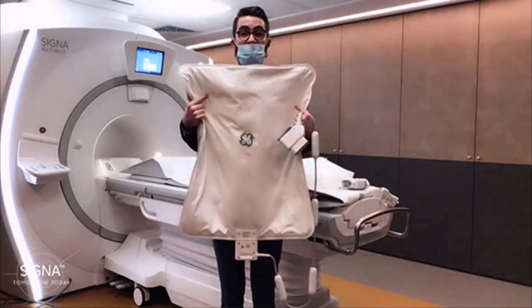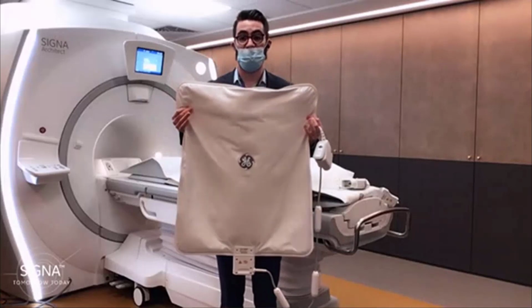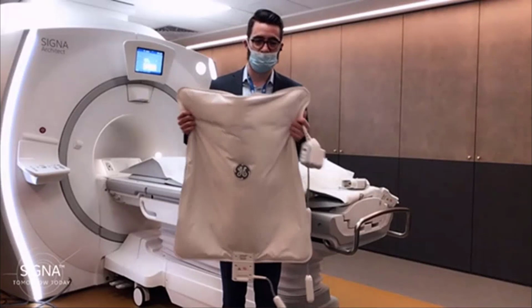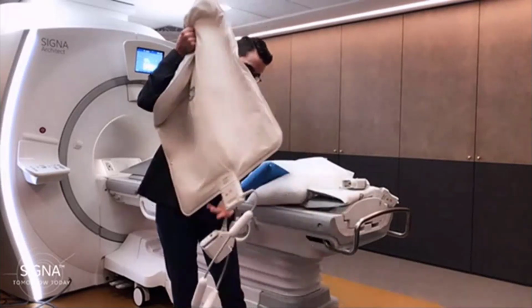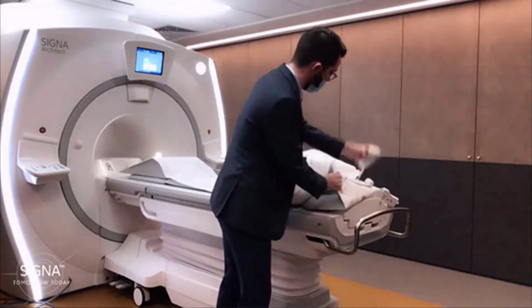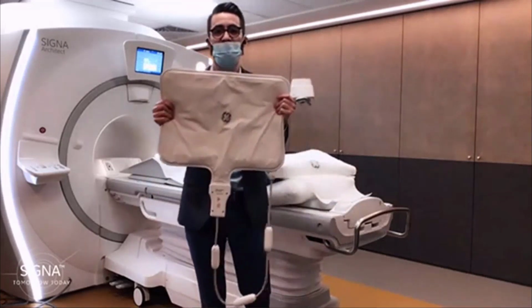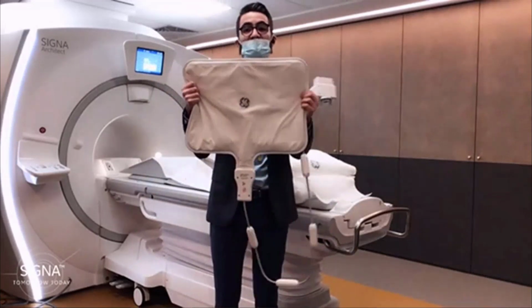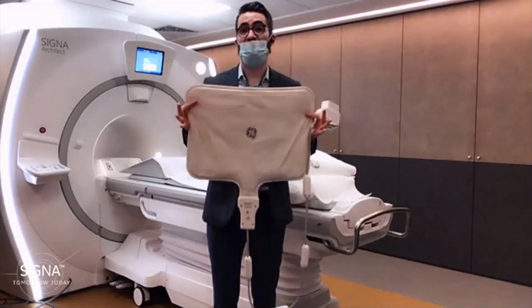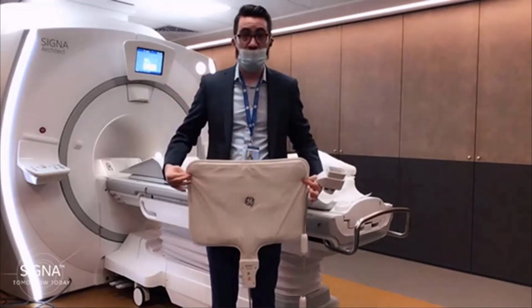And it's also a story of image quality. There are 30 elements embedded inside with the air coil technology, which gives you the possibility to use a high parallel imaging factor. And as we are talking about coils, I want to show you another one, which is also really important when we talk about body. Same family of products, the air family. This is the air MP coil, the medium one, because we have two sizes. Same kind of characteristics as the previous one. You have 20 elements on this field of view.